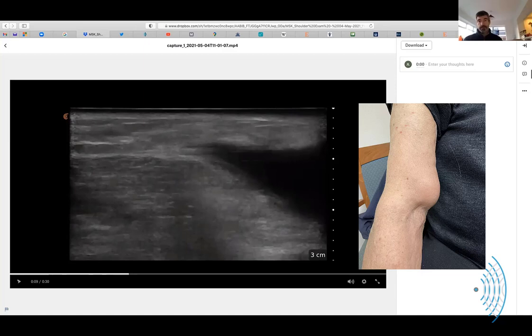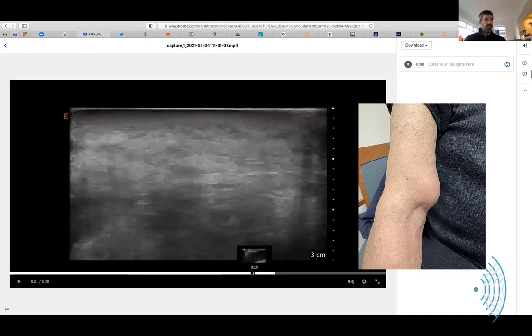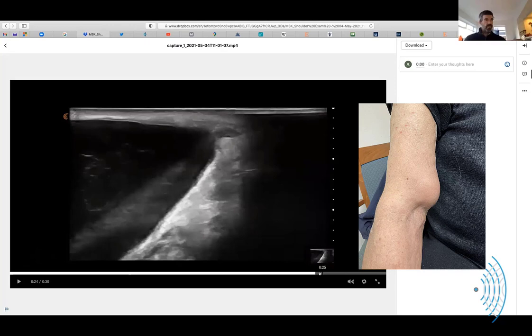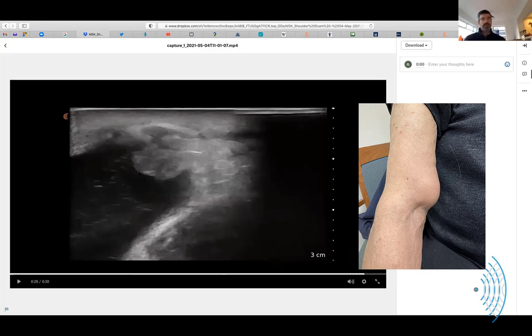Wow, so John. What I guess I told you in that email is that you found the edge of this dark zone, and it meant something to you. And what it meant to you is that this is not encapsulated. This is not like a cyst. This is a free-flowing, like a seroma. But it just looks to me like it has a gelatinous-like structure to it, and when I'm pushing on it, it did not move much. Exactly that. And that's very typical for blood products, after they've been there a little while.